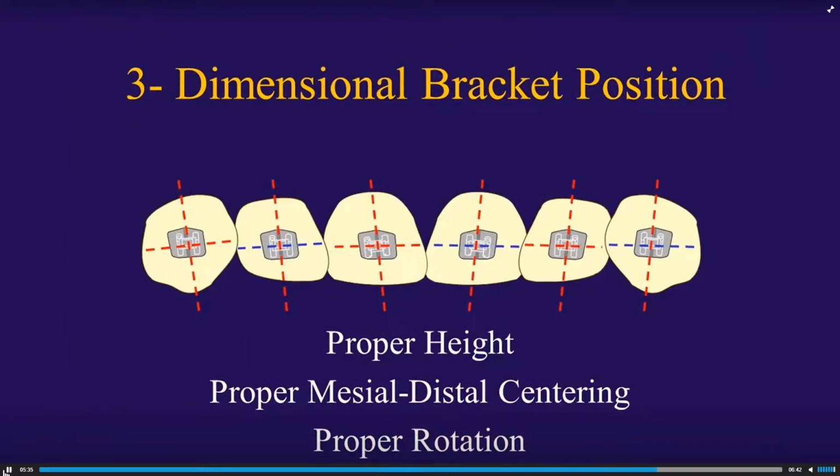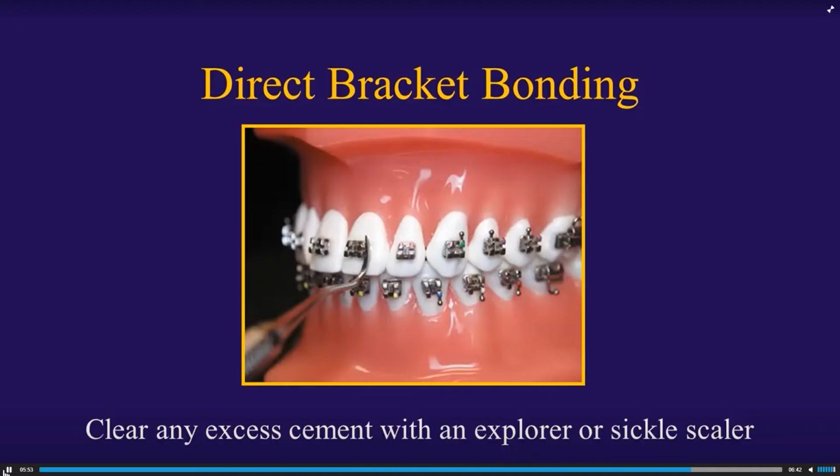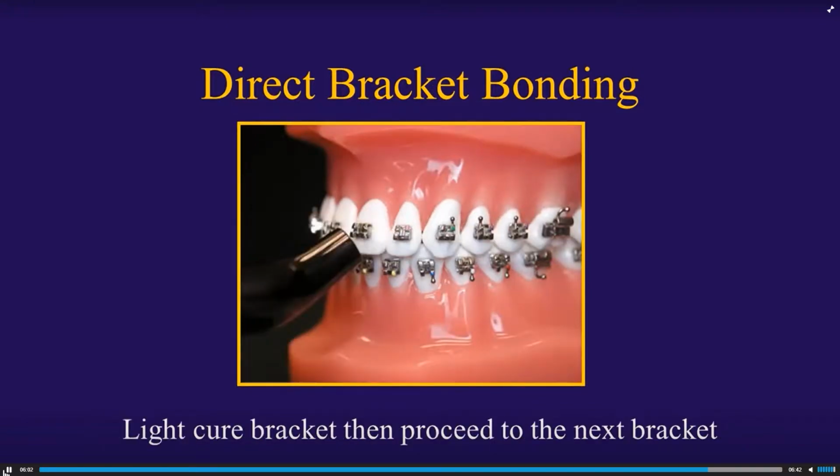Now you should have the bracket in the proper position in all three dimensions of space. You have the proper height, the proper mesial-distal centering, and the proper rotation. So that means that nickel titanium archwire can move that tooth far more precisely to that tooth's final position. Okay, next clinically you would clear off any extra cement you may have, and then just go ahead and light cure. And now you're ready to place, position, and cure the next bracket.